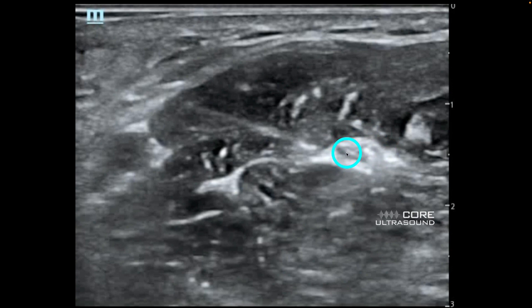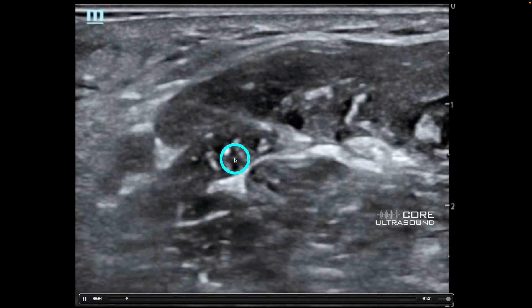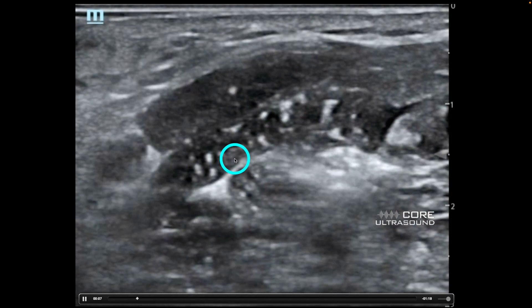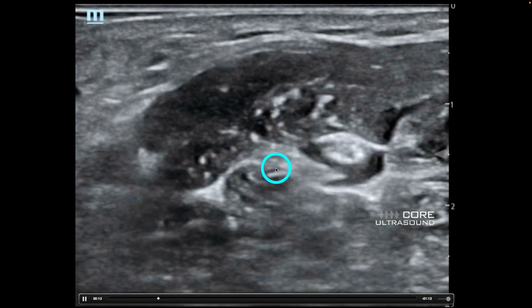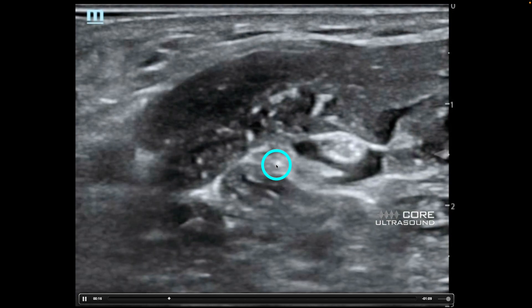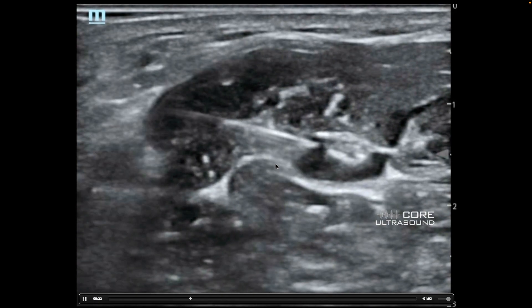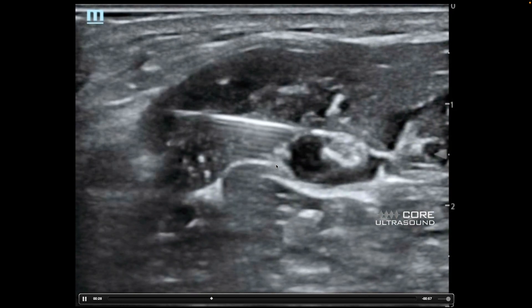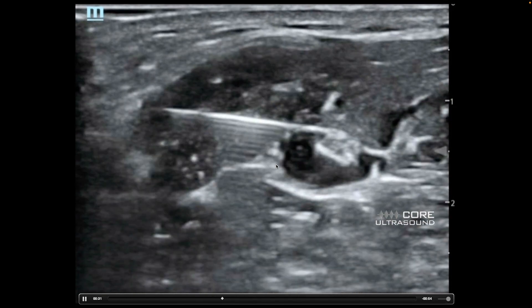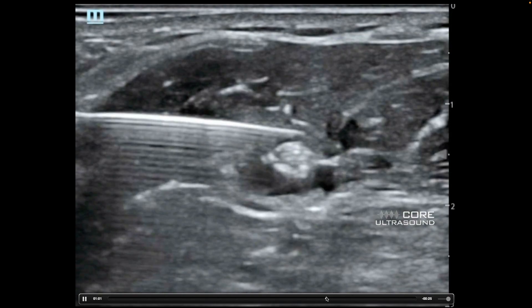I like doing these blocks in the long axis if I can, because you have really good visualization of the needle. What I'm doing here is using that needle to do little injections of anesthetic, really trying to get a nice donut around that nerve. You don't want to poke the nerve, especially with a cutting needle — it's better to use a blunt needle such as the nerve block needles we have. I'm being very diligent and slow with my movements to get a nice pocket all the way around that median nerve.